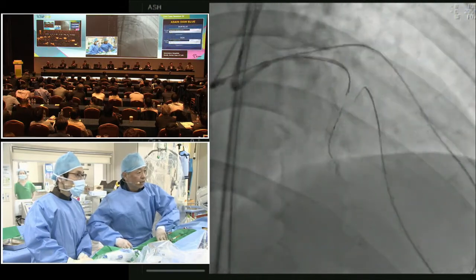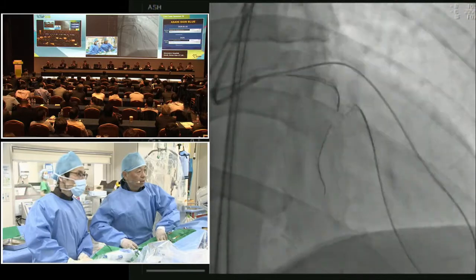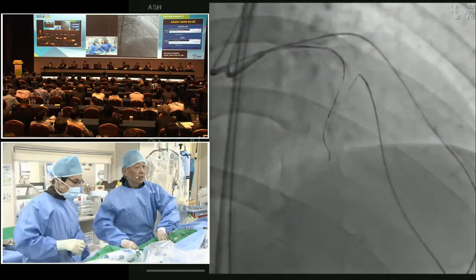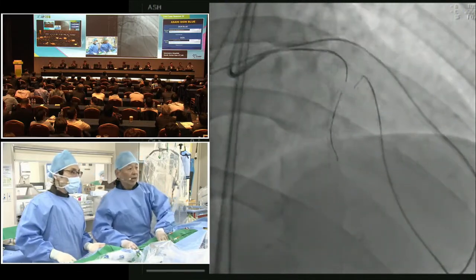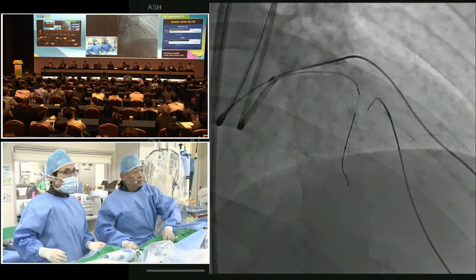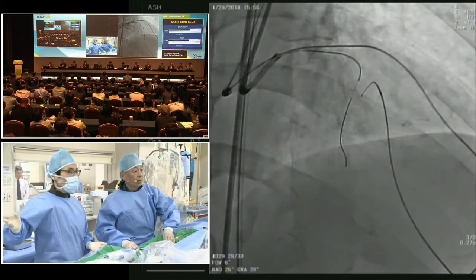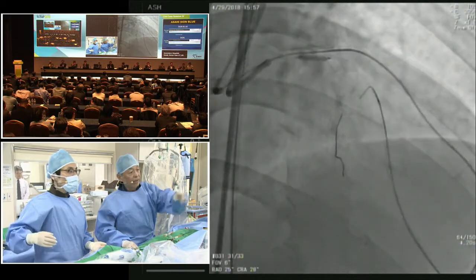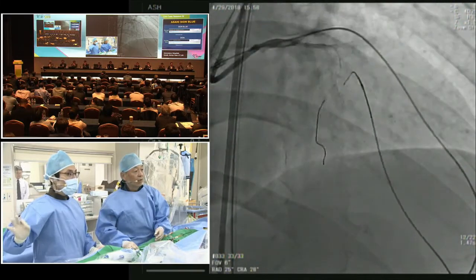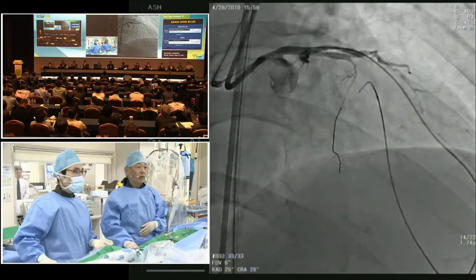And during this integrated setup, the patient complained of chest pain. The reason is the RCA, LAD proximal ostial region. So before starting this procedure, I dilated with a cutting balloon 2.5. Please show. Next one. Okay, this part, like this. And after balloon dilatation by cutting balloon, the finding is improved. So currently the patient complains of no chest pain, a very stable condition.